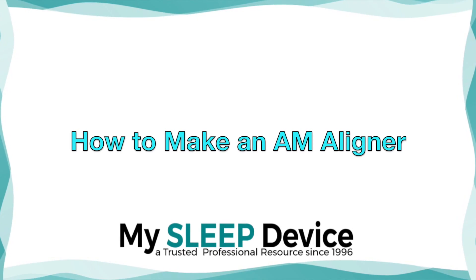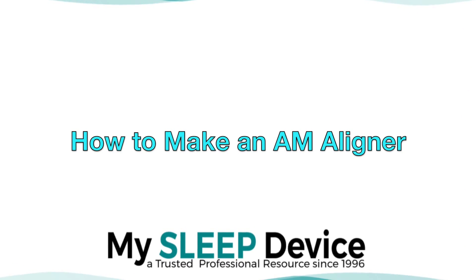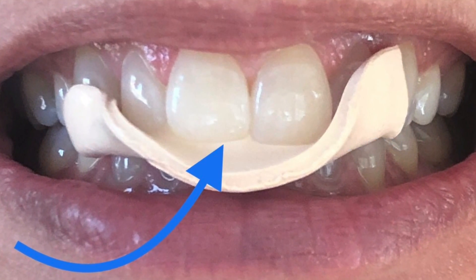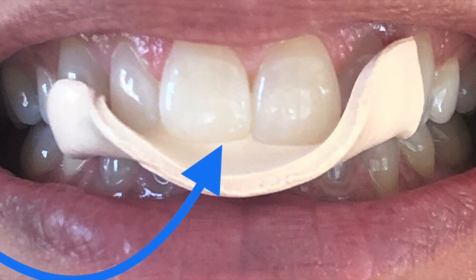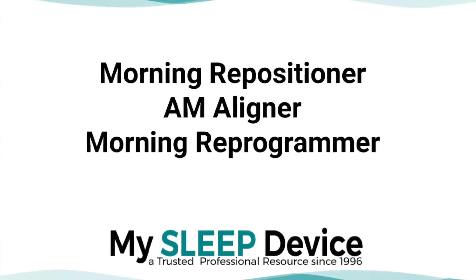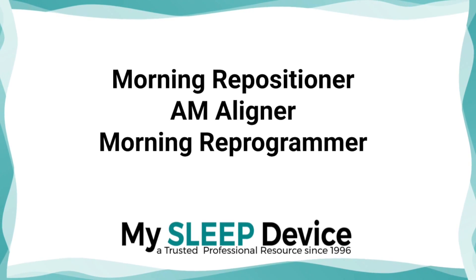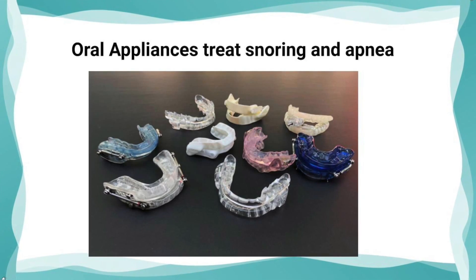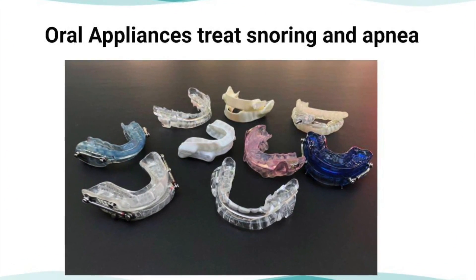Hi, today I will be providing a demonstration on how to make a tool that can be used to prevent bite changes that are common in oral appliance therapy for the treatment of snoring and apnea. This particular tool can be called a variety of names — morning repositioner, morning aligner, or even morning reprogrammer — but they're all trying to do the same thing: help prevent your bite from changing and help bring it back to a natural bite after you remove your oral appliance in the morning.